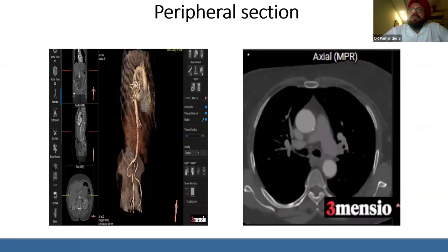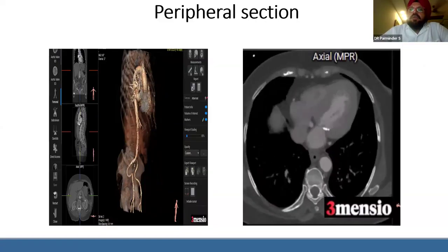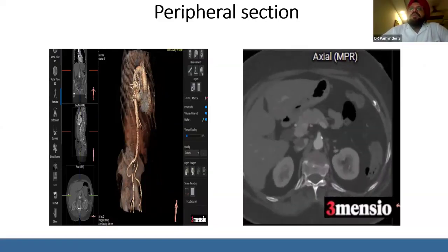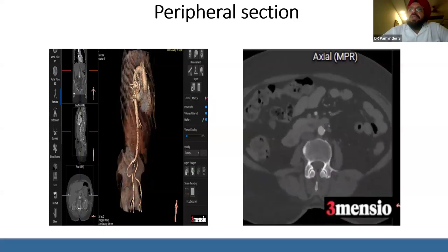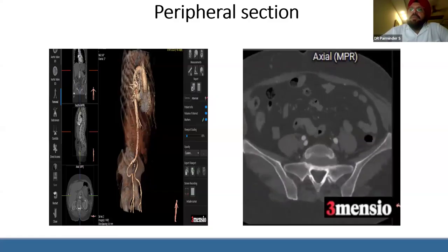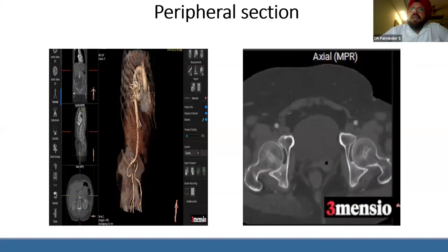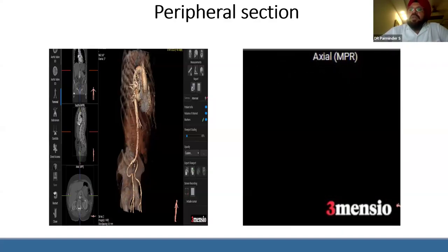It is really helpful. It will tell you where you have aneurysm or thrombus or exophytic plaques or stenosis or calcifications, where you are going to get into trouble, where you have to be more careful while negotiating your transcatheter heart valve or delivery system. And it will show you where the bifurcation is in relation to the femoral head.